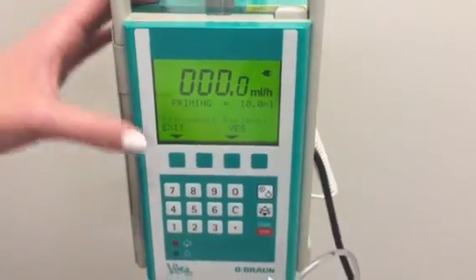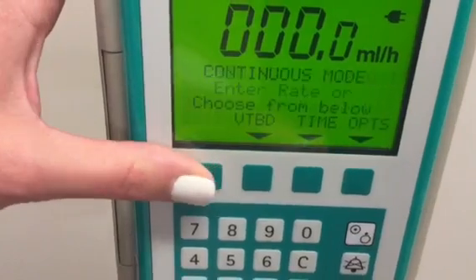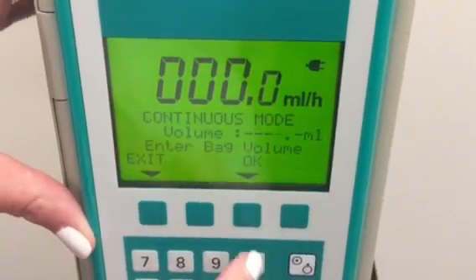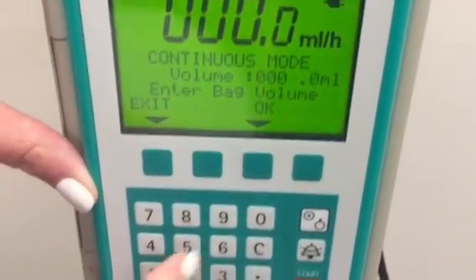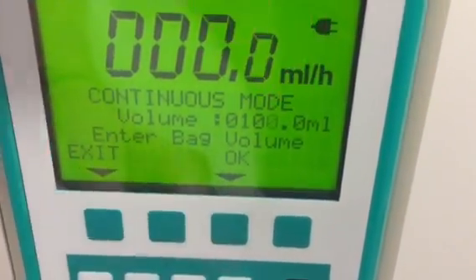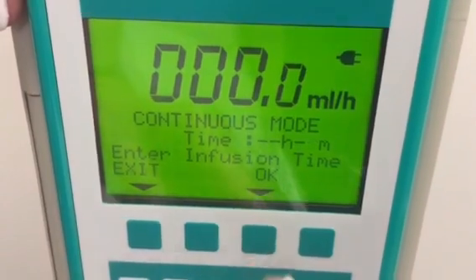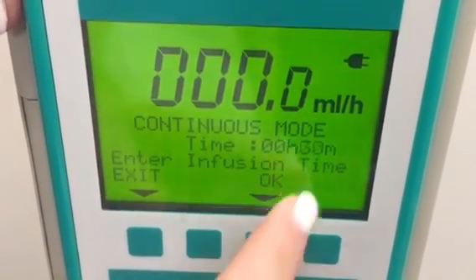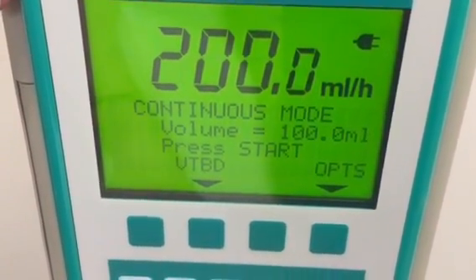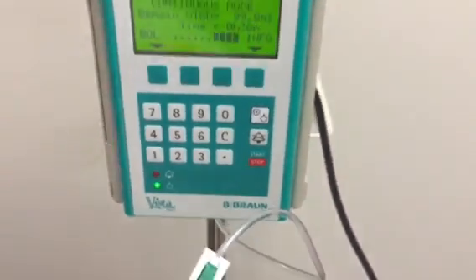Almost done priming. We're gonna go ahead and exit that — we're still disconnected from the patient. We're gonna choose our volume to be infused and enter bag volume. Let's say we're gonna do 100 ml's. Now we're gonna choose our time — let's say we want to infuse it over 30 minutes, so 3-0, 30 minutes. Accept rate. Now we're gonna press start. At this point, you want to make sure that your roller clamp is unclamped.